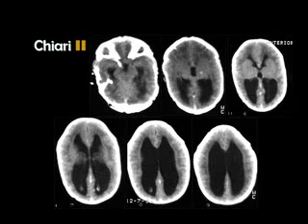There are major differences between the Chiari and the aqueductal stenosis. Number 1, in the aqueductal stenosis, the third ventricle is ballooned because the obstruction is very near to the third ventricle, and this is not the case in the Chiari. In aqueductal stenosis, the lateral ventricles are symmetrically dilated.